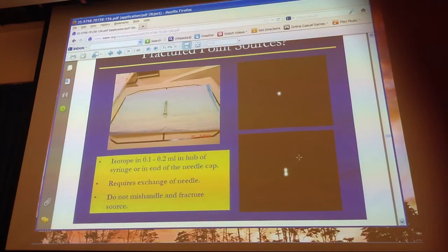Okay? How would I know that? Well, it would look like all my images had ghosts. There'd be like something on the outside of it. Or I'd get like a double exposure. Okay? If I wasn't paying attention to stuff like that, then this is an issue. What they need to do is adjust the ratio circuit and the X and the Y gain. In this case here, because it's in the vertical orientation, this is a Y gain problem.